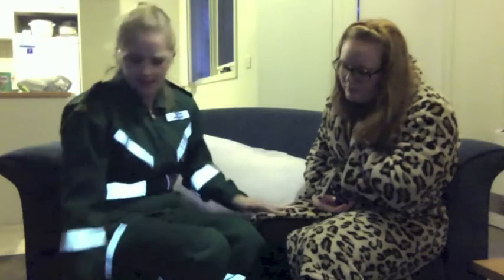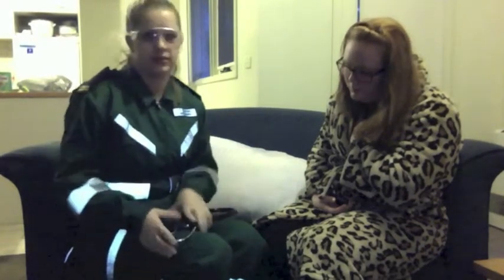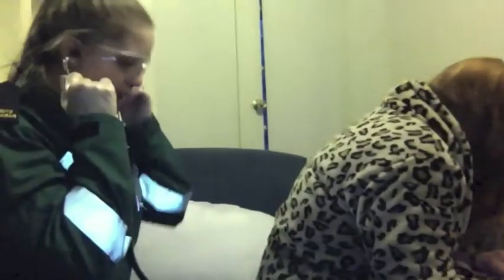So now I'm just going to do a chest auscultation on Mrs. Jones. I will be listening through the clothing, but normally it will be done on skin. Okay? So you're just able to turn around for me, Mrs. Jones. That's it. Good, and then I just want you to have your hands like this on your legs. Good, and just leaning forward. Good, and can you just do a big nice cough for me? Good, just to clear anything that might be stuck in the airways.